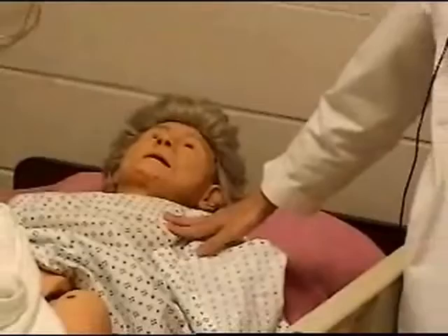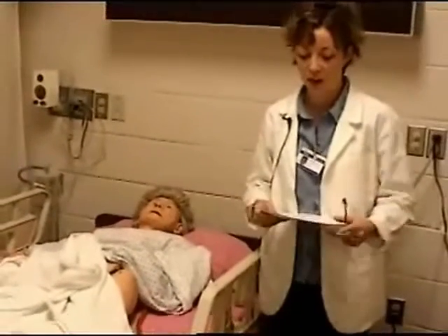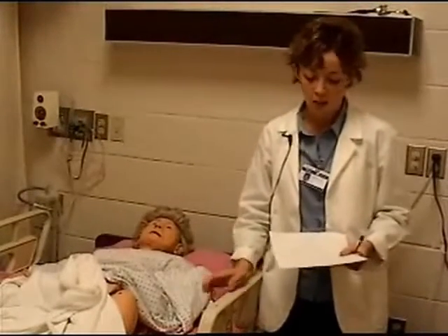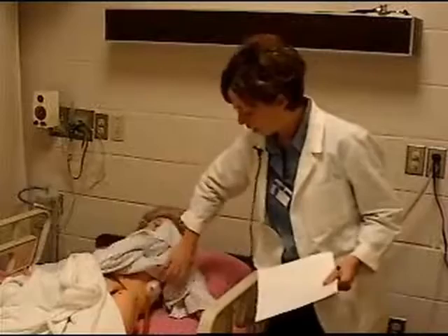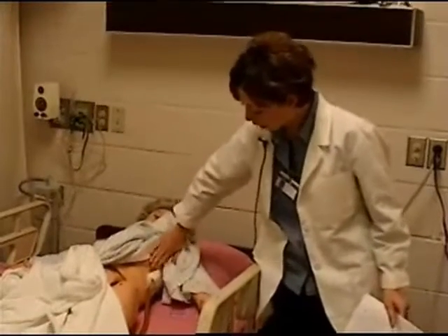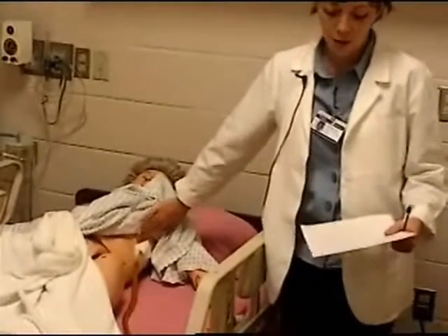Things that we assess when a patient has a chest tube. We need to assess lung sounds, respiratory status, and know their baseline. What is their baseline, and are they deviating from that at all? Signs and symptoms of cardiac tamponade. Is the dressing dry and intact? Are they leaking around this dressing? Is there crepitus if you touch around this dressing? Those are signs that the doctor needs to be notified immediately.